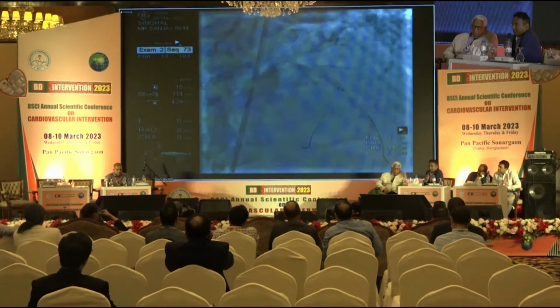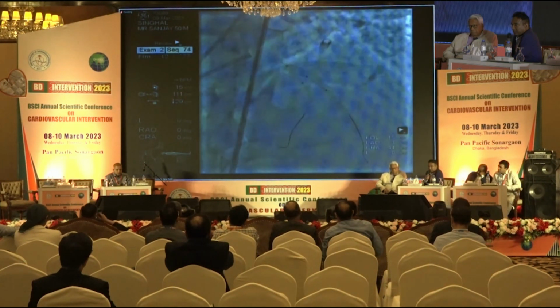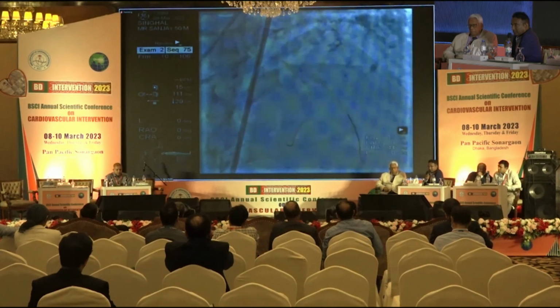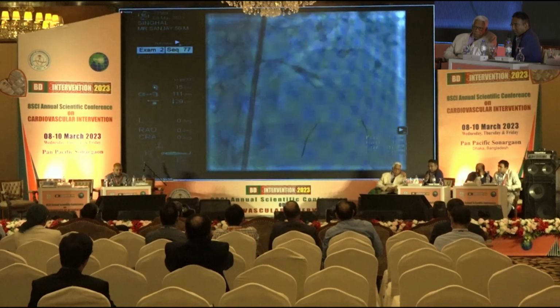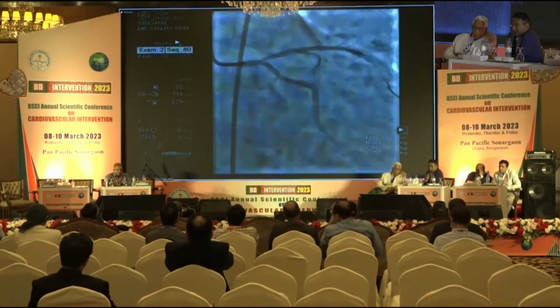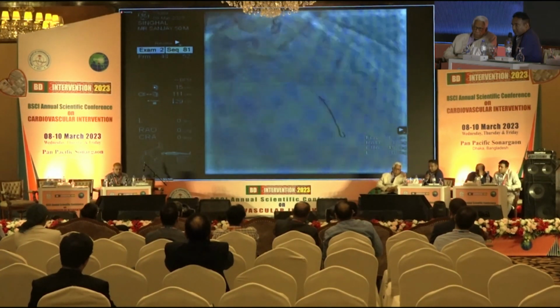We recrossed into the septal and did a kissing here. This is the kissing, the septal as well as the LAD. And then we did a final high pressure dilatation. There was no place for, as you know, a POT, but we brought it to the ostia, and that's it. And then we did an OCT. This is the final result, as you see here.